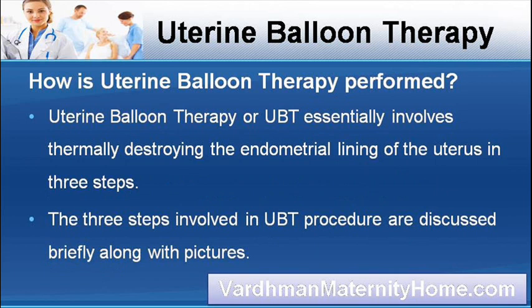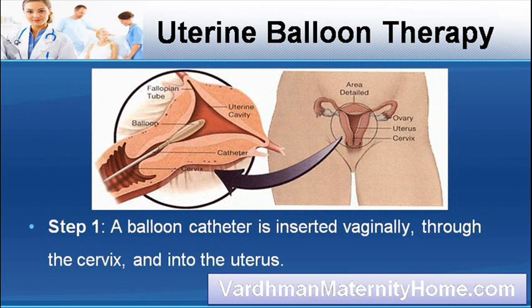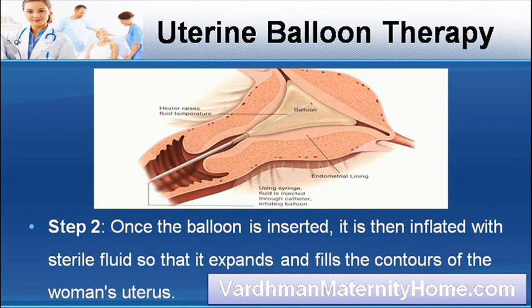Uterine balloon therapy, or UBT, essentially involves thermally destroying the endometrial lining of the uterus in 3 steps. The 3 steps involved in the UBT procedure are discussed briefly along with pictures. Step 1. A balloon catheter is inserted vaginally, through the cervix, and into the uterus. Step 2. Once the balloon is inserted, it is inflated with sterile fluid, so that it expands and fills the contours of the woman's uterus.